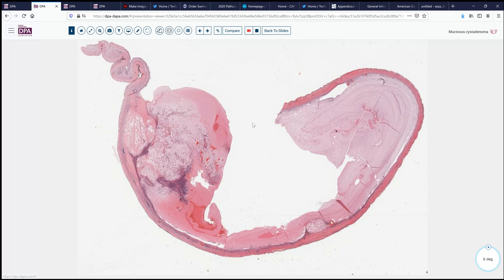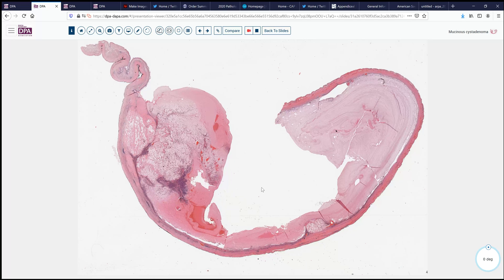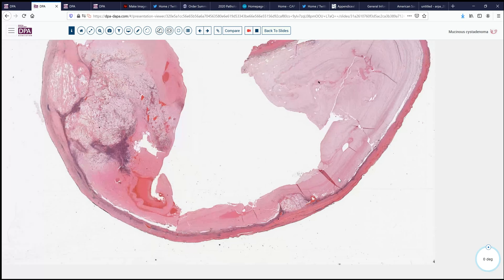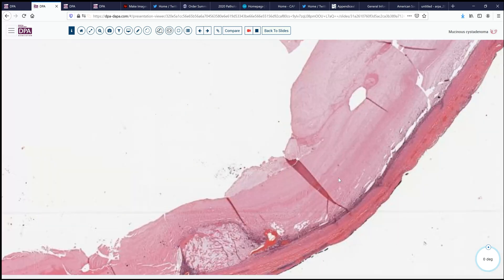This is the appendix, the whole mount, and you can see that the lumen is dilated by this abundant mucinous material. And there are some areas of slightly altered appearance in a couple of areas. Even at low power, we can appreciate that there are some hyaline fibrotic changes going on here. So let's see what, if any, epithelial cell changes we can identify.